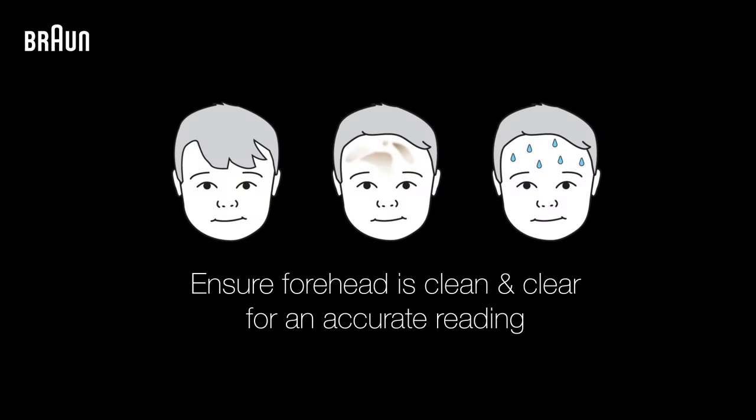To help ensure a reliable measurement, hold the thermometer steady and make sure that any hair, dirt, or sweat is removed from the forehead before taking a temperature.